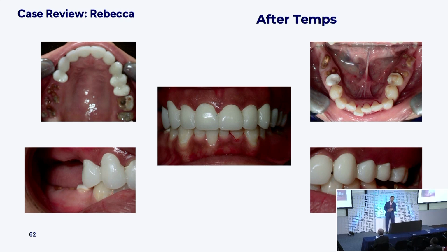If you want to rebuild a set of crowns across the top teeth, I would love for the bottom teeth to be nice and straight. Because the lower incisors, canine to canine, really premolar to premolar, that's not where it belongs, and I would love to spread that out. And if I do spread out the lower, it will have an effect on my beautiful, nice restorative work on the top. So this is now ready for clear aligners. So decay removal, temporaries placed, scaling and root planing, plaque and calculus gone, tissue healing.